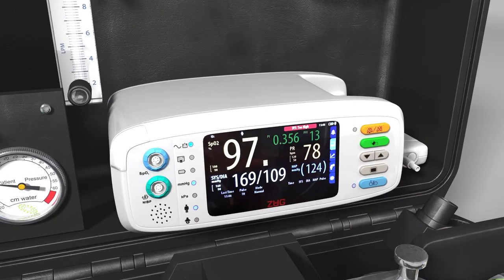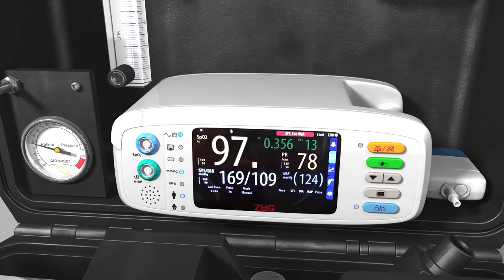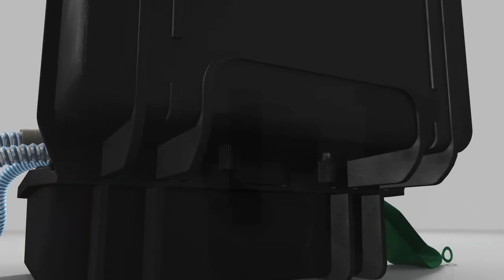The patient monitoring options provide continuous and accurate monitoring with an intuitive user interface for accurate readability of all parameters. The monitor can be fitted or removed by a simple screw mechanism.